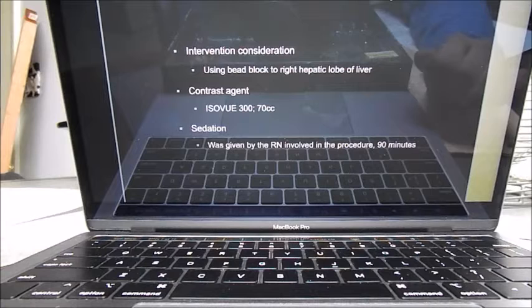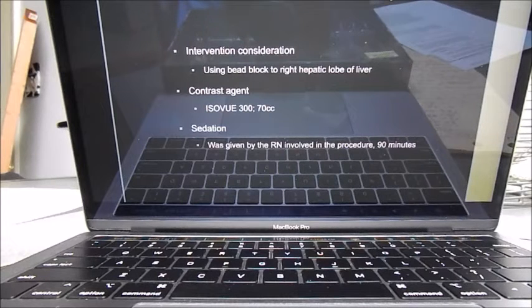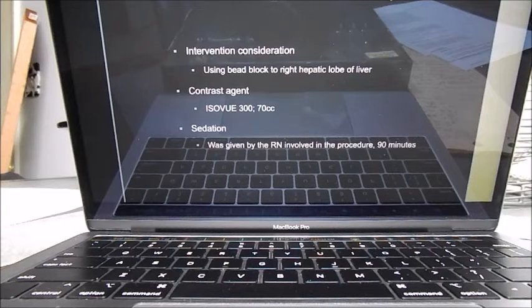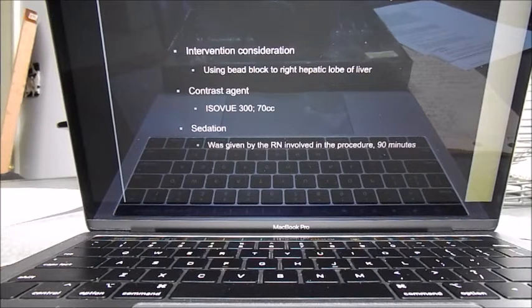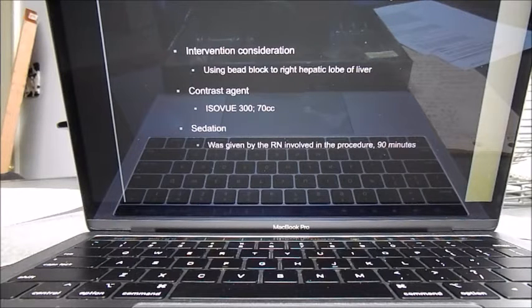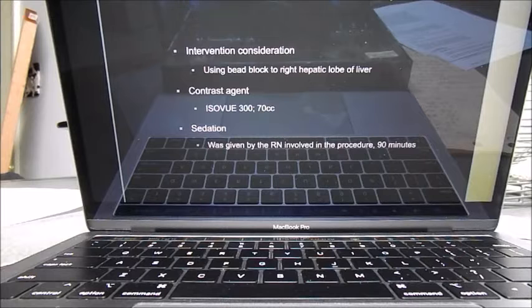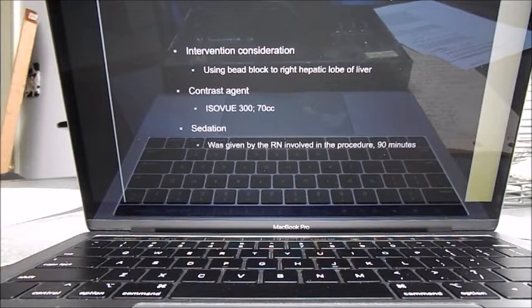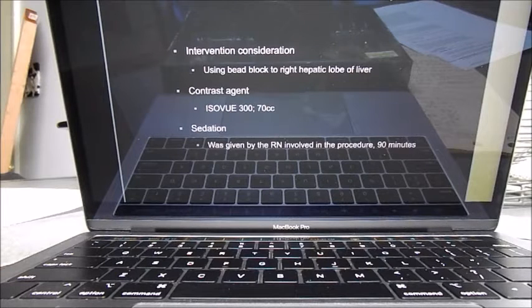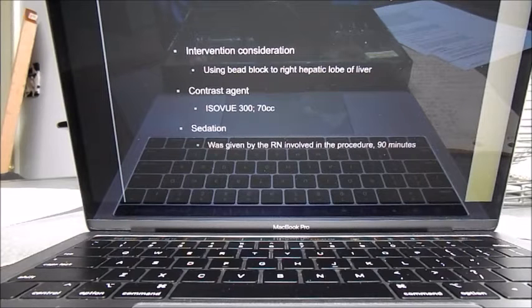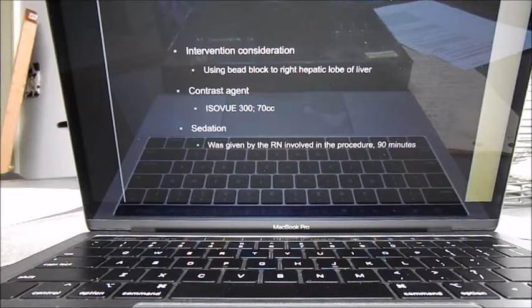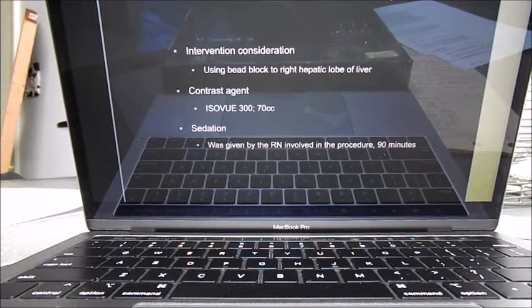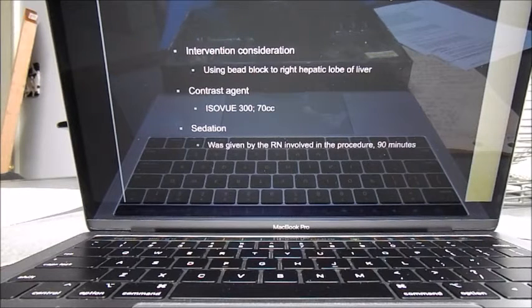So during this procedure, what we did was we accessed the right femoral artery. We went in and, same as before, numbed up the skin, used ultrasound for the initial puncture with the micropuncture. After we found that, we used the micro wire, took the needle out, put the catheter sheath or put the dilator sheath on, took that out, put the Benson in. After getting the Benson wire in, we took our 5 French sheath and replaced that dilator sheath.